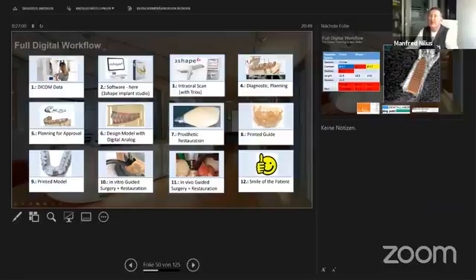You have a printed row of teeth. Then you have this guided surgery template, and finally you do the operation as you planned, and finally we hope you have a smile of a patient.